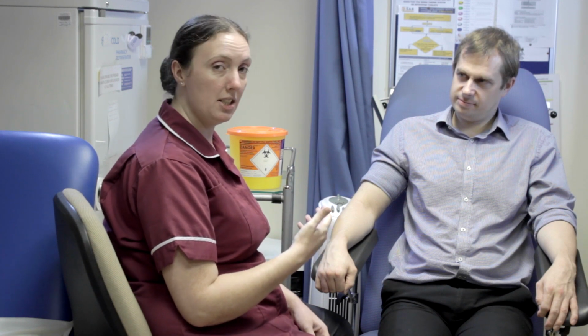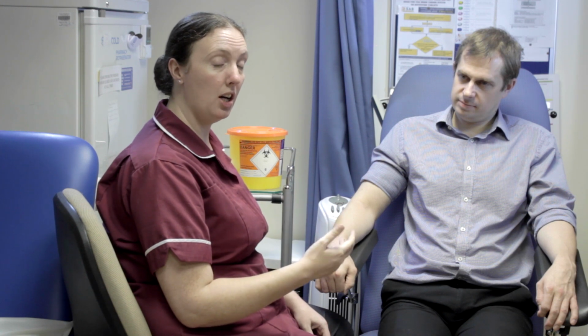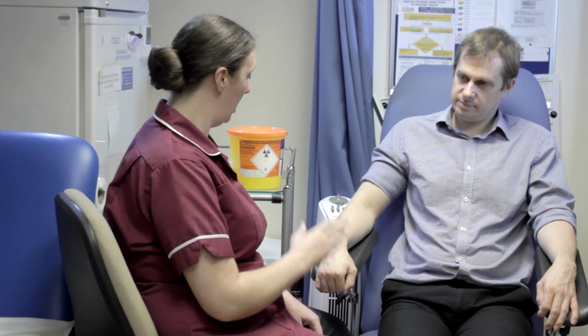Perfect. Next, I need to identify him. So we use 3 separate identifiers for every single patient. If we don't use those 3 separate identifiers, we could find that actually we're going to the wrong patient or we're misidentifying as we go. So, in order to identify my patient, I would always ask for their full name, their date of birth, and either their address, or if they're in hospital, I'll take their NHS number from their wrist strap.